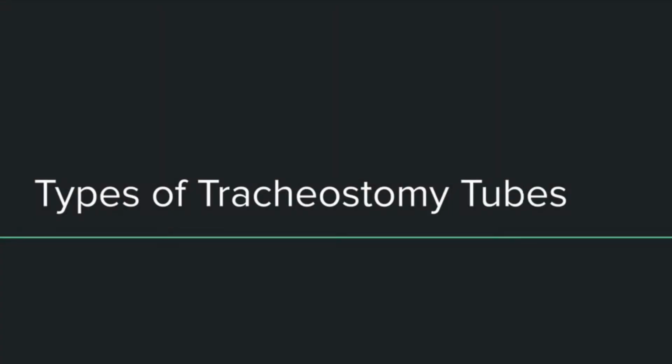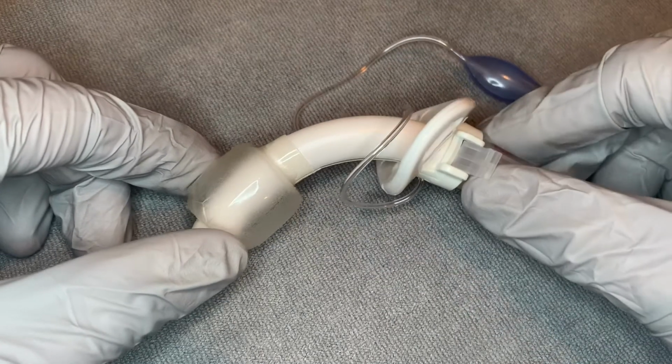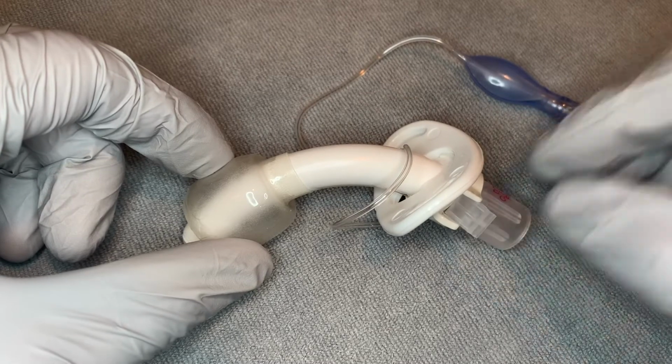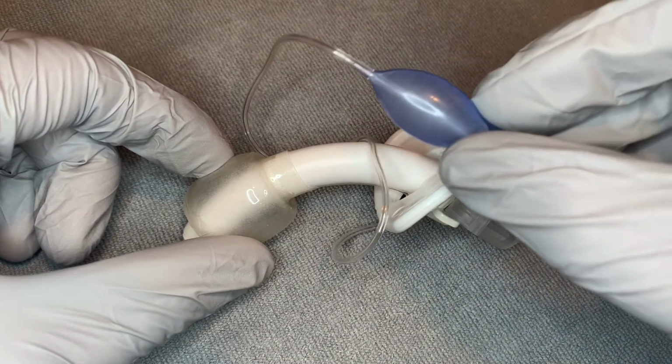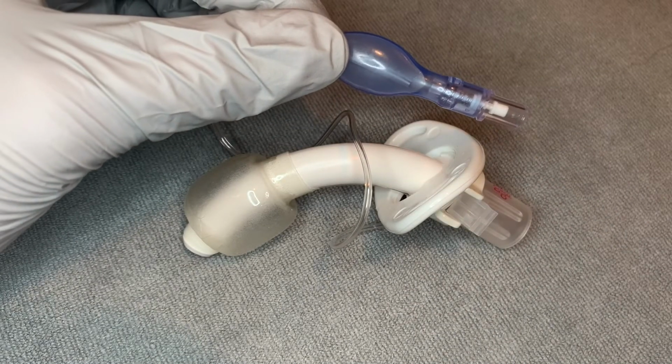Tracheostomy tubes differ based on size and other characteristics. Most are made of plastic. When one first receives a tracheostomy tube, it often has a balloon on the end of it called a cuff. This cuff can be inflated externally through a piece called the pilot balloon with a syringe. The cuff helps prevent leakage of air for patients on the breathing machine during surgery.